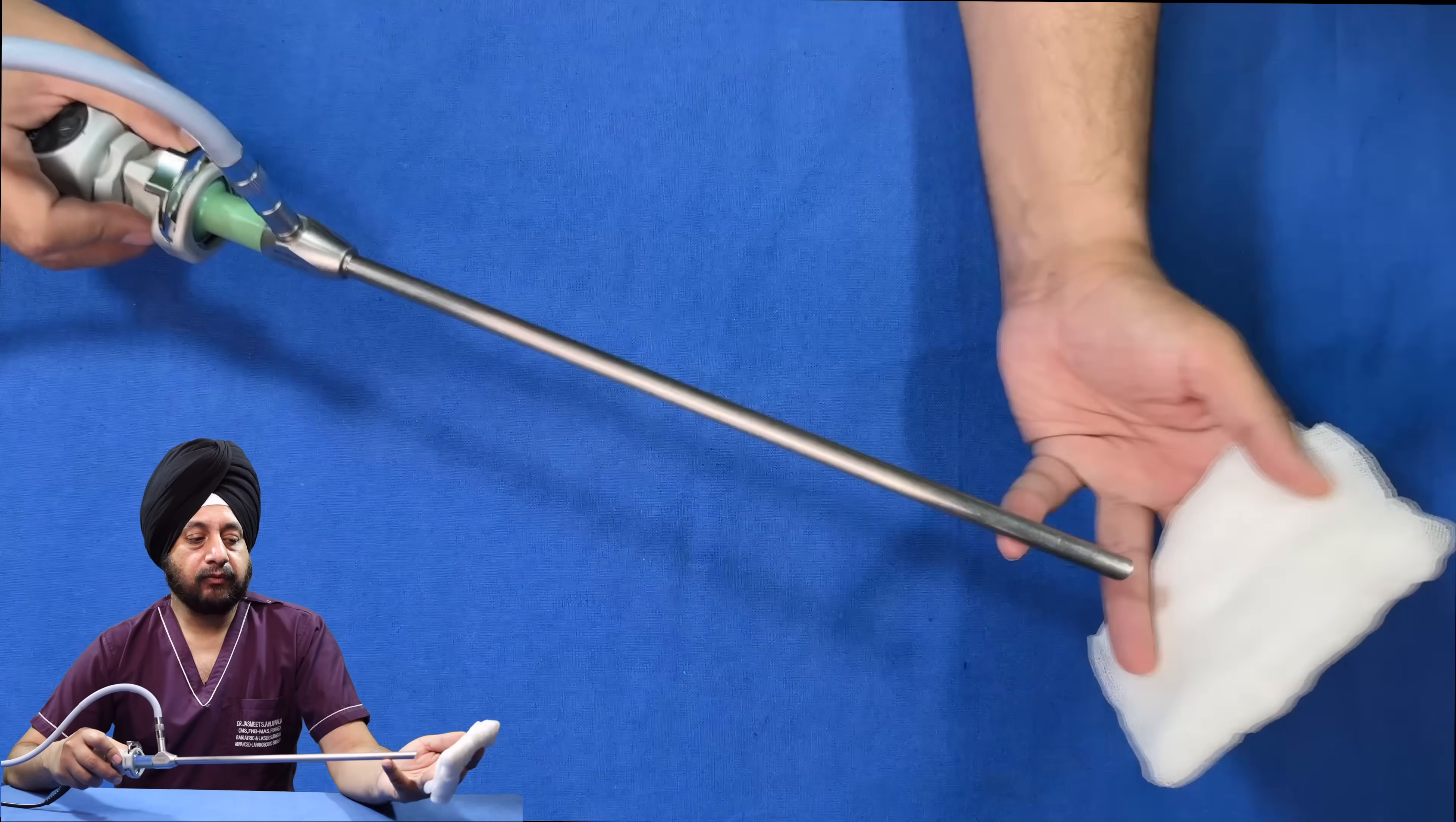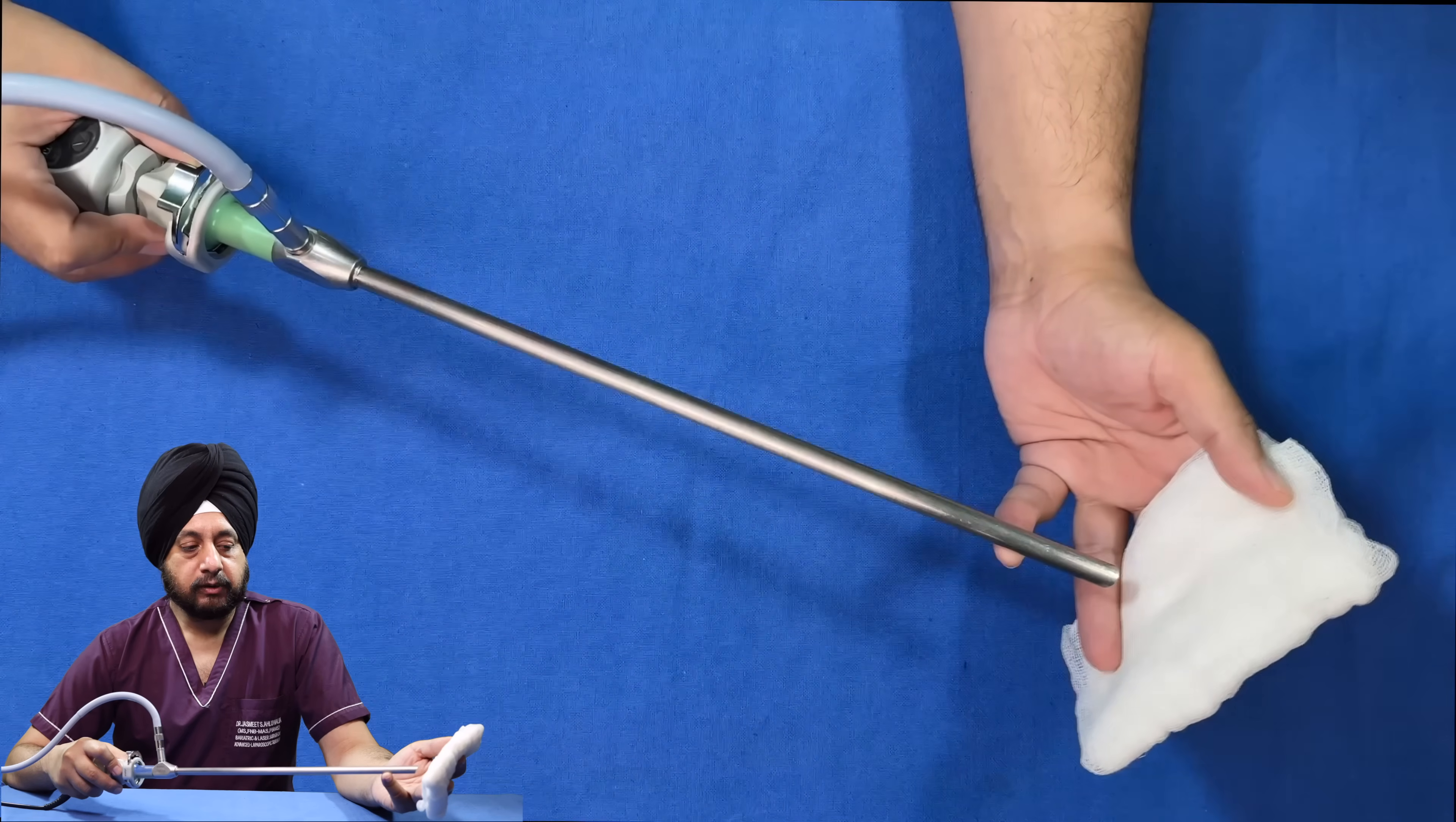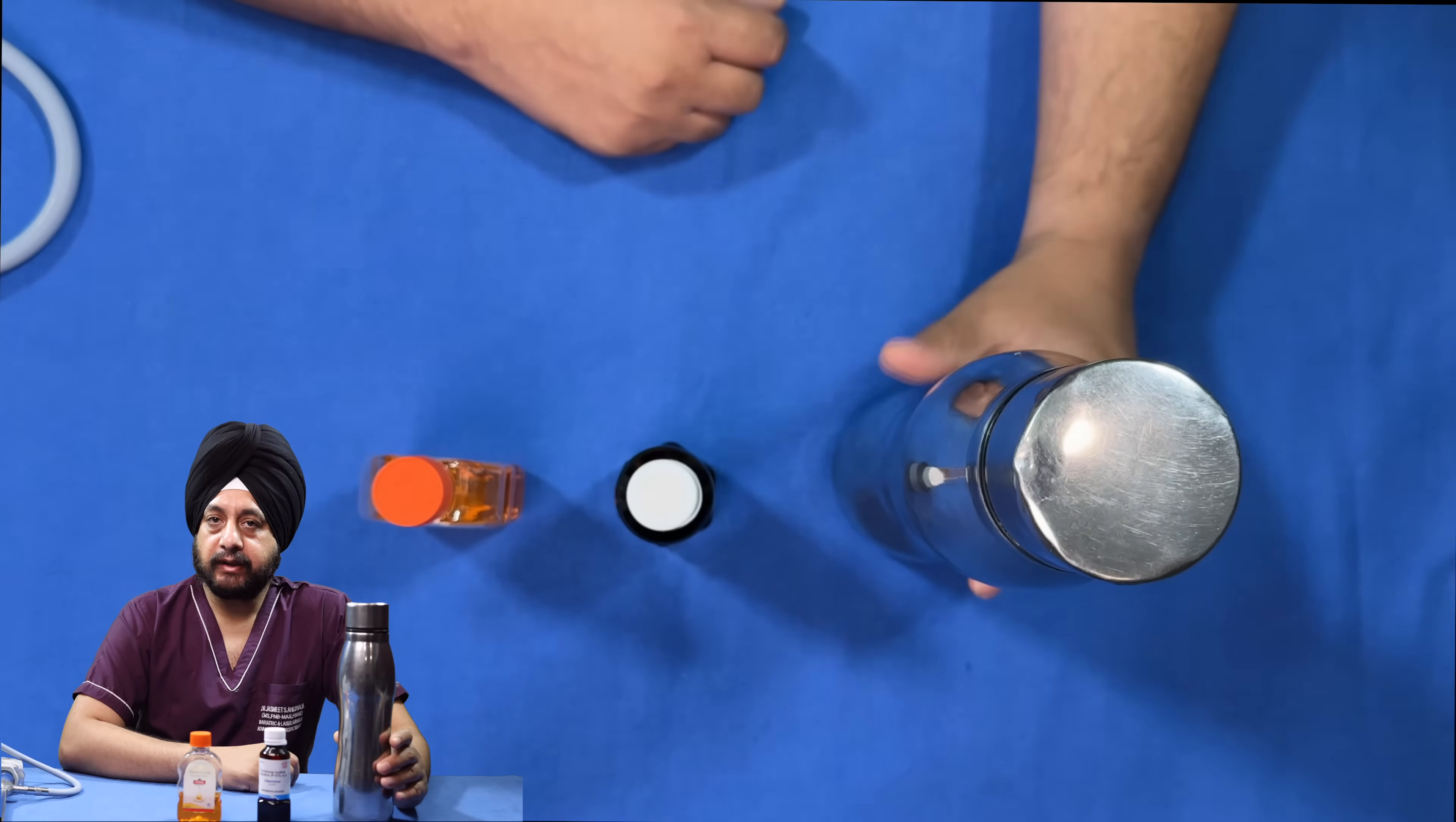If your scope is too far away, you may include areas which are not actually white. Make sure you are away from the overhead light which can change the color of your gauze because it might be yellow. Also try to set the light intensity a little lower than 100 percent so it's not too bright when auto focusing.